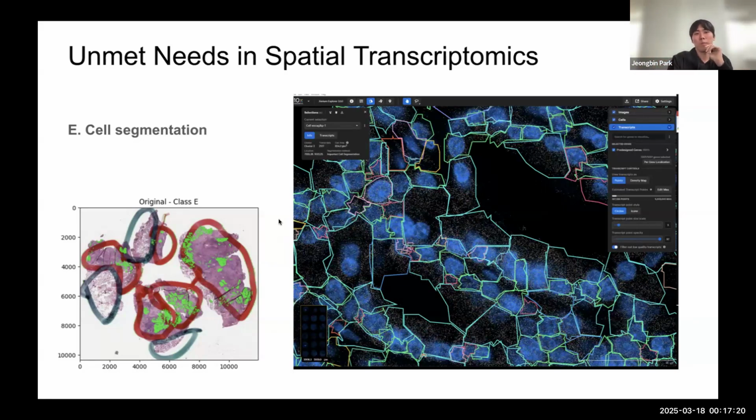And even if many scientists are trying to use digital pathology models, there are pen markings, a lot of artifacts, and poor quality data sets. But it's not easy to eliminate that type of poor quality data because it requires human manpower, it requires time, it requires a lot of cost. It's not automatic, it's not scalable. So it's kind of an issue.